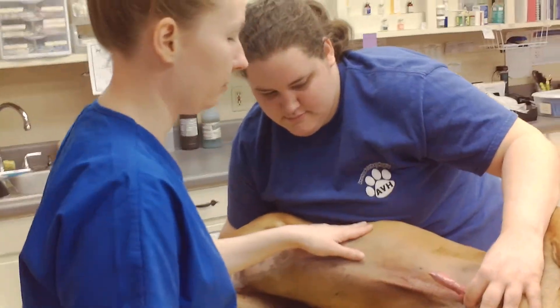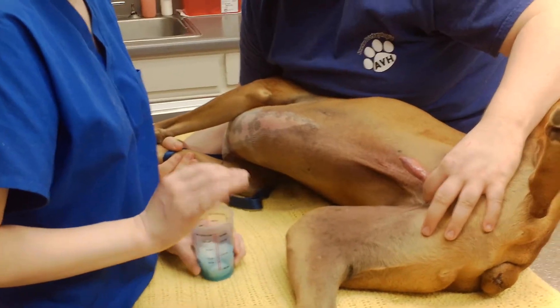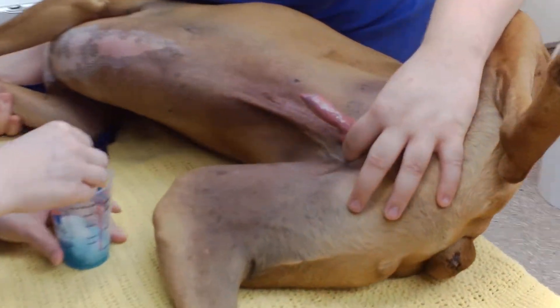Alright, this is a urinary catheter on a male dog. We've already got his glans exposed. I'm going to go ahead and get him scrubbed up and ready to go, just to show you what it is that we would do.